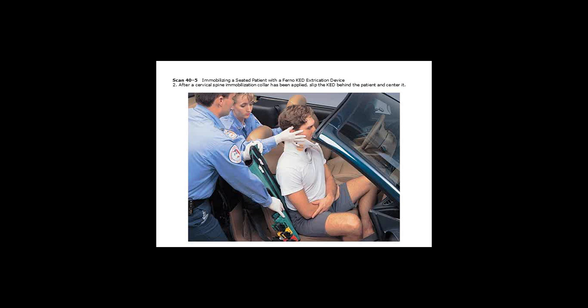After you've applied the C-collar, you may need to have the patient adjusted forward. If that's the case, you'll do a sandwich technique — one rescuer holding the KED will sandwich the patient front and back, and on the count of the person holding the head, lean the patient forward, slide the device in behind them, going down as far as possible with the bottom of that device. Then take those leg straps off, one draped down on each respective side of the patient.